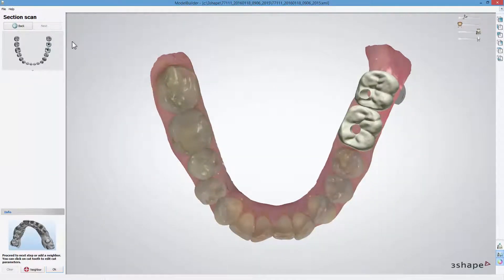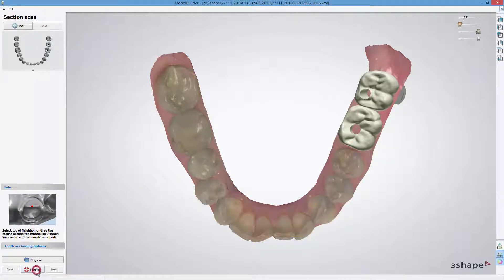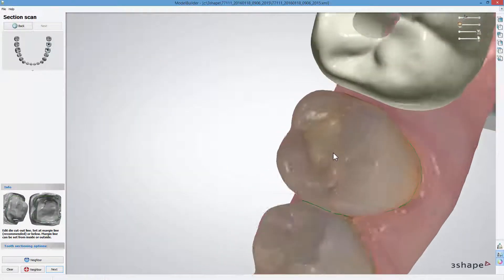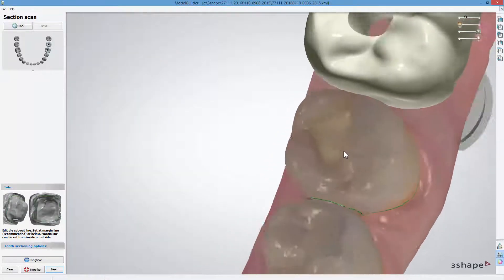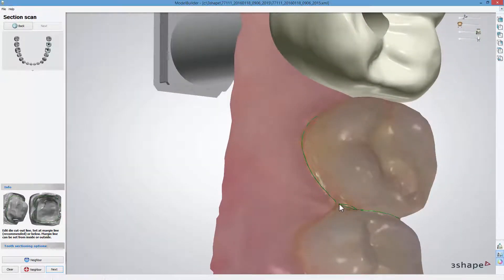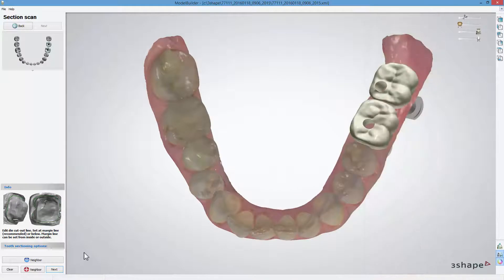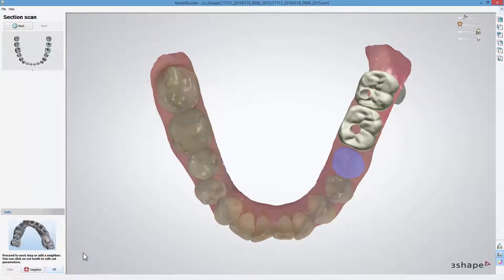At the Section Scan step, you can section neighbours in your scan by clicking the Neighbour button. Follow the on-screen instructions to section the neighbouring teeth, and click OK to go to the next step.